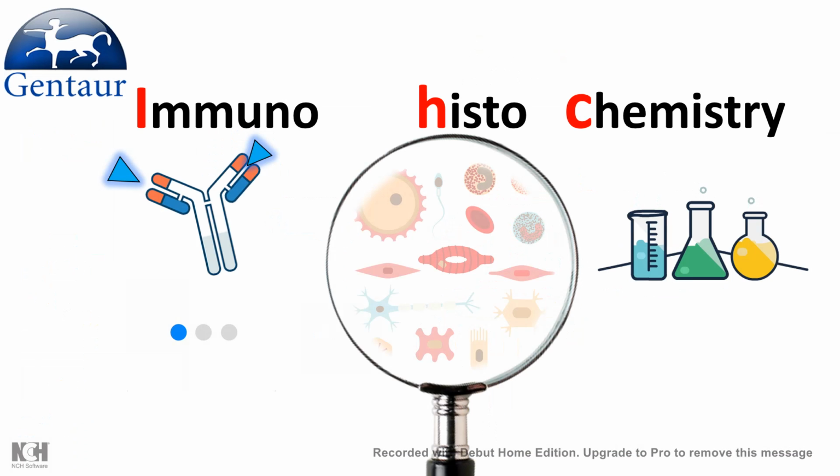What comes to your mind when you hear the term immunohistochemistry? So let's analyze the term. Immuno, it is something associated with antibodies. Histo, that's something associated with tissues or cells, and chemistry, some kind of chemical reactions.